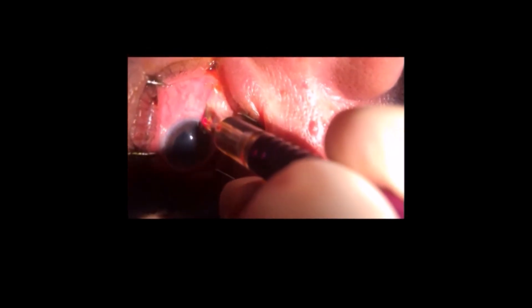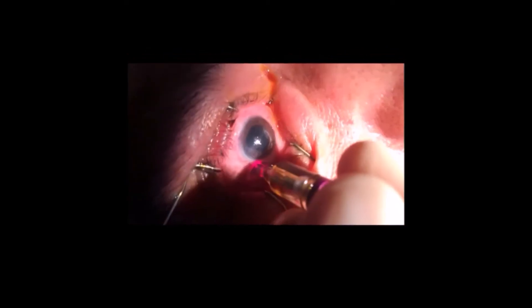A couple of days post procedure the IOP was still around 45 under a lot of medication, and a week after the pressure went down to 12. So I think it's a good procedure for uncontrolled IOP glaucoma cases.